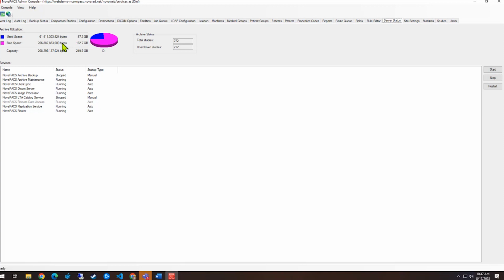If you guys are looking at it, if you have a concern, or especially if you guys are adding modalities, or say you're going from 2D to 3D mammo and you just have a concern about space, let us know, and we'll make sure that everything is good as far as that goes.